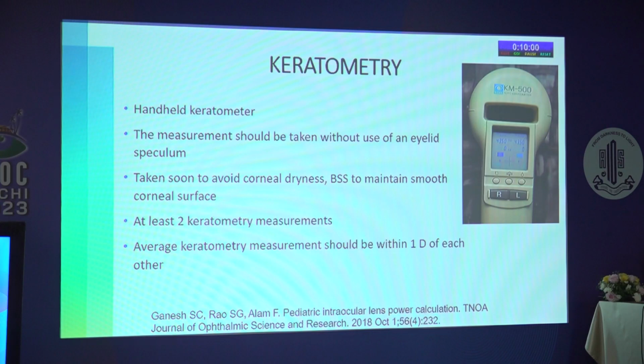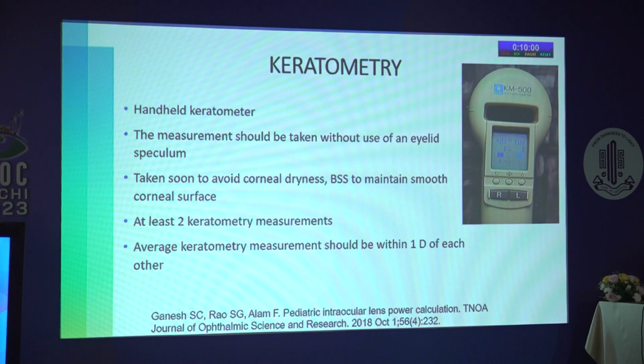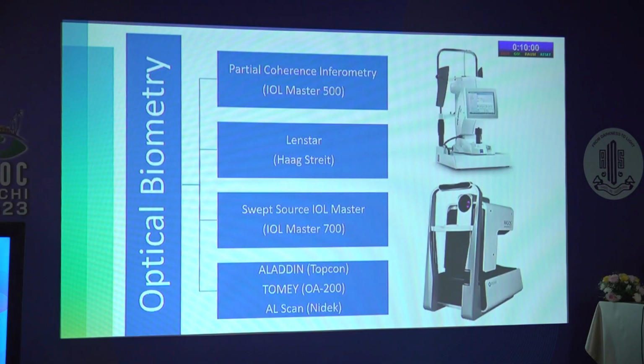Next. So for keratometry, handheld keratometers are now available. Under anesthesia you can measure the keratometry and calculate the IOL power. Optical biometry in the older children is possible, but in the newborn baby it is not possible.